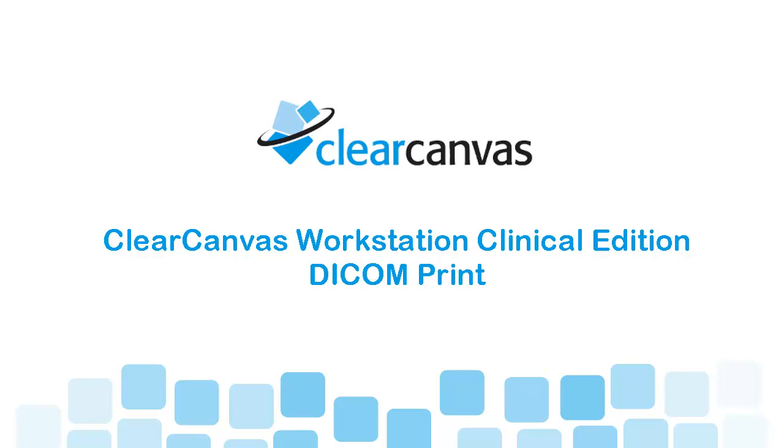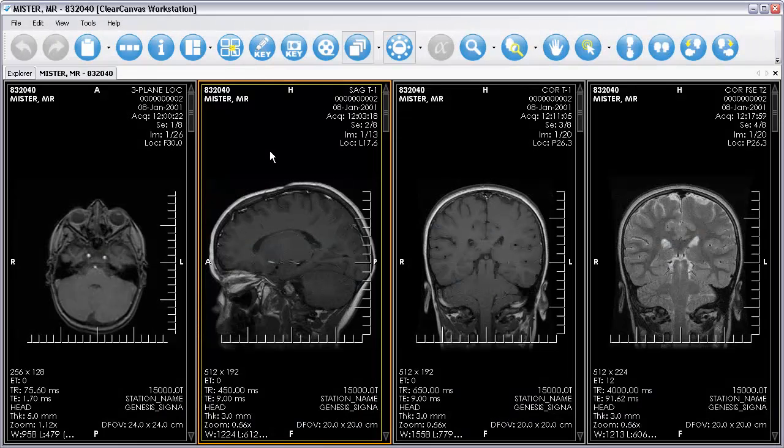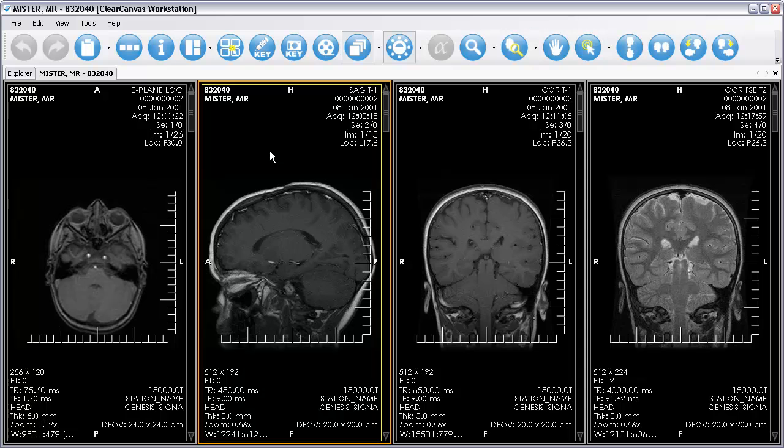Hi, my name is Jonathan and I'm a software developer at ClearCanvas. Today, I'm going to introduce the Dicom Print feature that's part of ClearCanvas Workstation Clinical Edition.